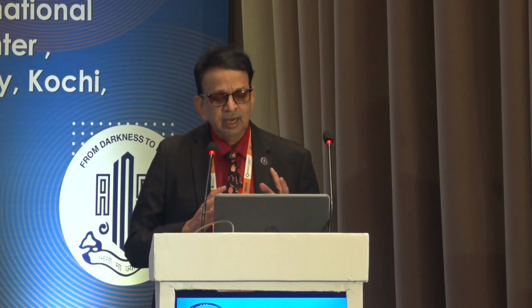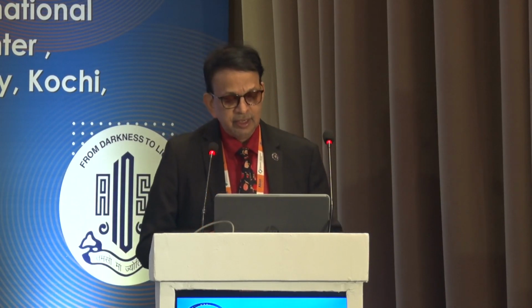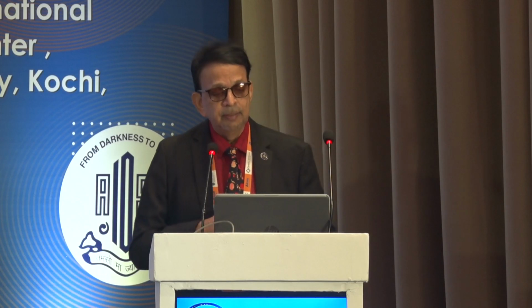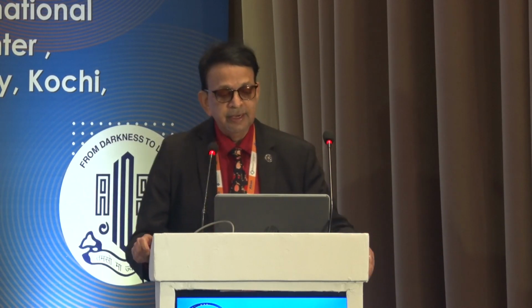Again, a patient with a subluxated hard cataract. What is shuttlecock injury? The shuttlecock injuries are probably the worst injuries one can ever have, and you can see here how the entire nucleus is wobbling around. The rhexis is the most important challenge in a subluxated cataract. So the rhexis is done.